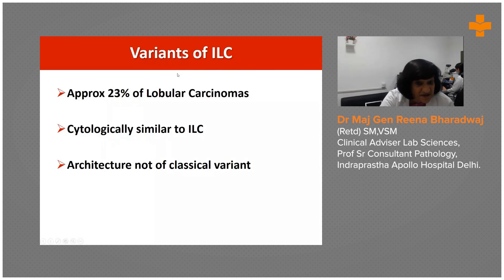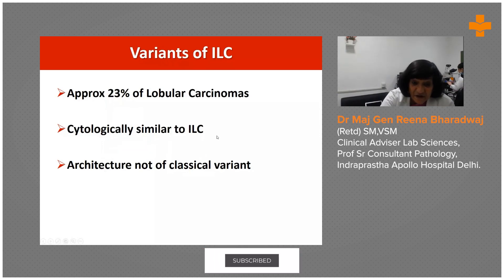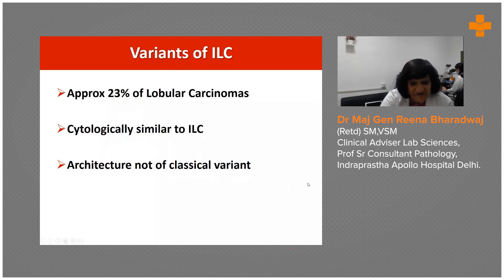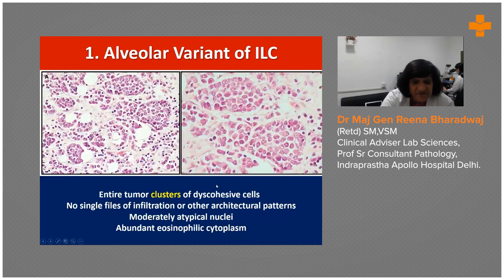The classical form is the most common, accounting for around 75% of cases. In the variants — approximately 23% — the cytology of the cells is identical: monomorphic and meek-looking, but the architecture is not classical, which can cause confusion. The alveolar variant has meeker cells; the entire cluster still appears discohesive but arranged in the form of alveoli. They may be a little more atypical, not as monomorphic, and may show more abundant cytoplasm. Please beware of the alveolar variant.